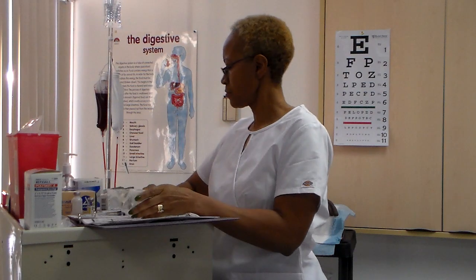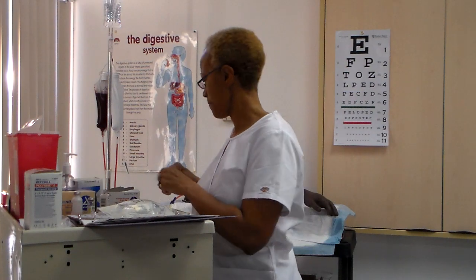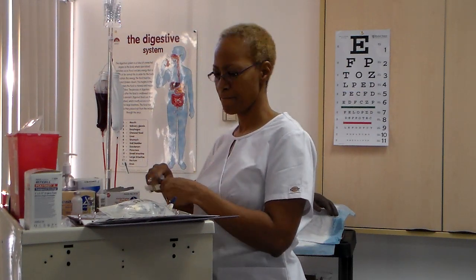Perform hand hygiene. Compare labels of medication and IV fluid bag with MAR. Again, you look at your expiration date, your solution, of course, your bag, and then you look for your expiration date. Add medication to new container. Usually done in medication room or at medication cart. A. Solution in a bag. Locate medication injection port on plastic IV solution bag. Port has small rubber stopper at end.